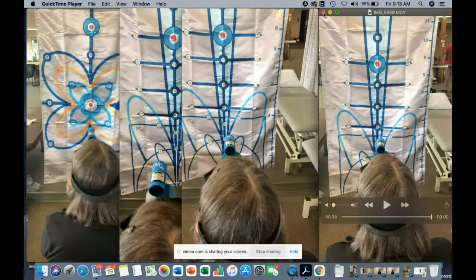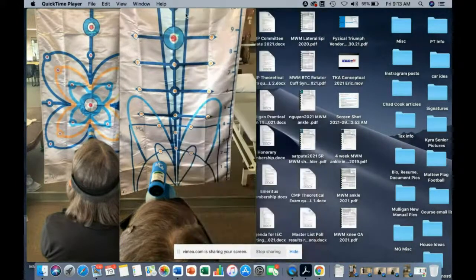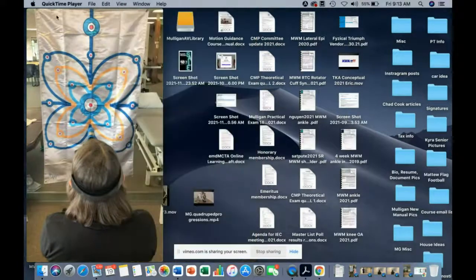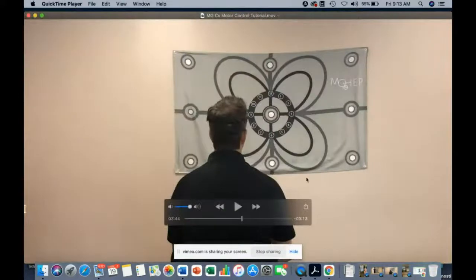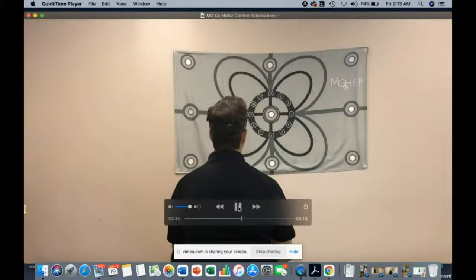So those can help for people who are trying to understand what their VOR should look like, as well as how it should feel. And go with those ocular and motor things. So another common thing that we can do with head control with those same patients is go with motor control patterns. So we just get the laser on their head.